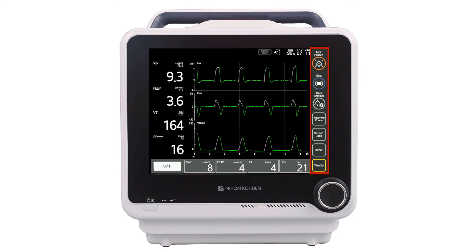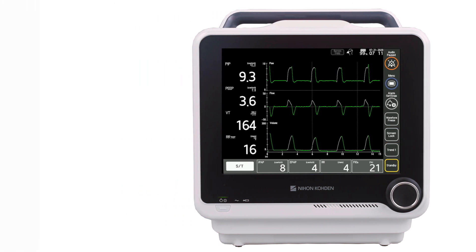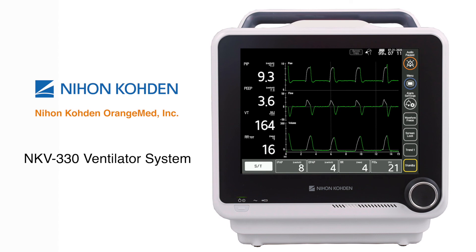The operational keys section provides direct access to certain functions. The three upper keys — audio paused, menu, and alarm settings — are fixed in these positions. The four lower keys are user configurable. On this screen, they are currently configured for waveform freeze, screen lock, trend one, and standby. This concludes the introduction to the NKV-330 ventilator.